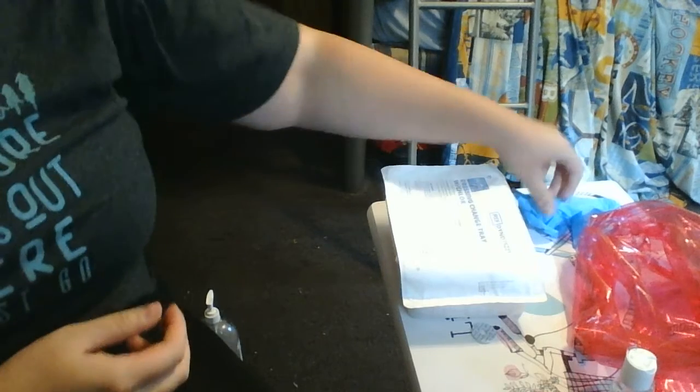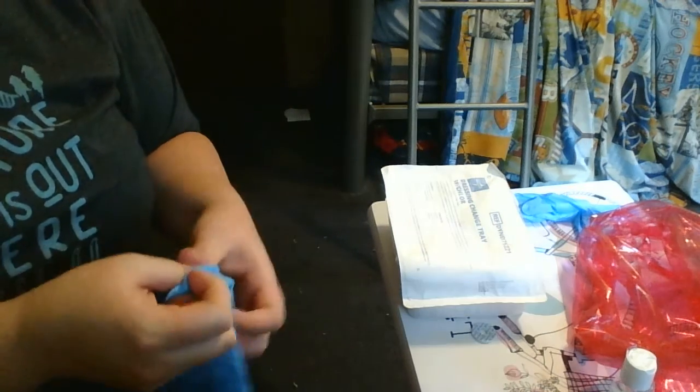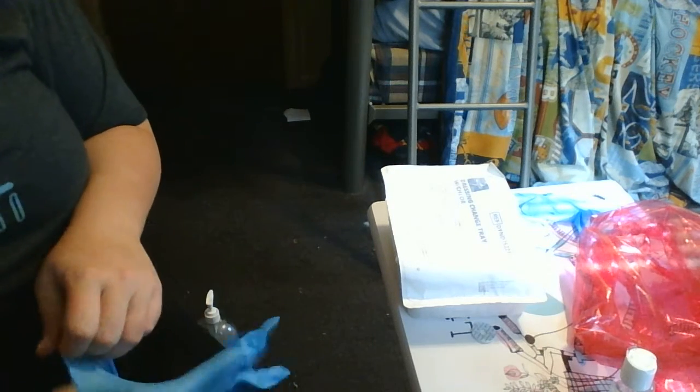I'm going to apply my clean gloves. And these are just regular gloves. They're not sterile.